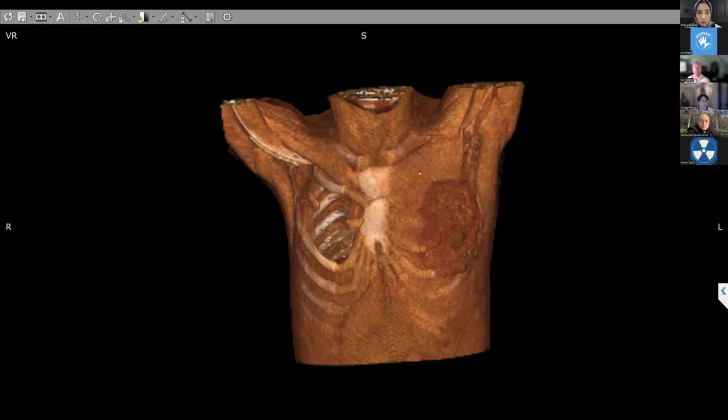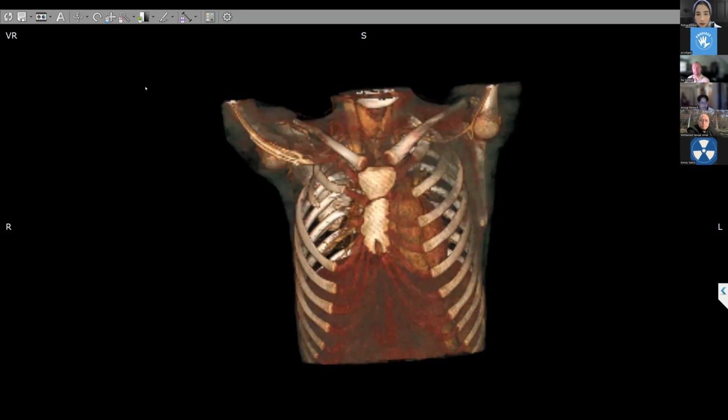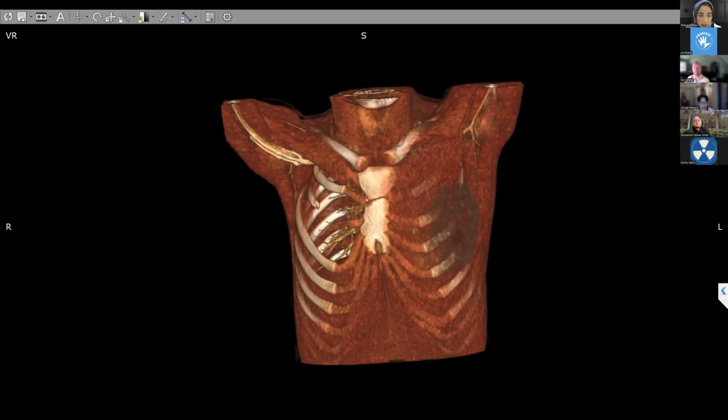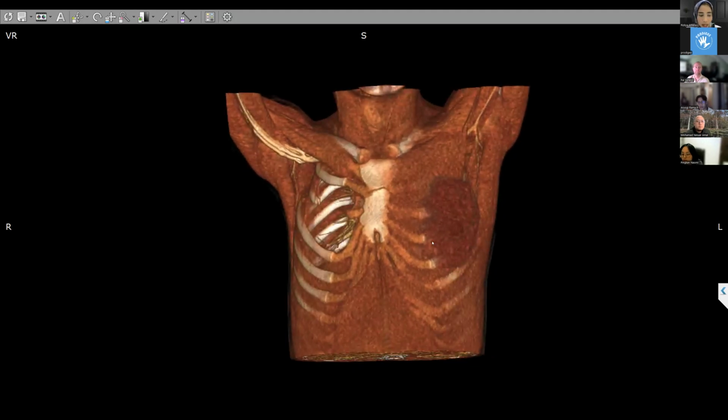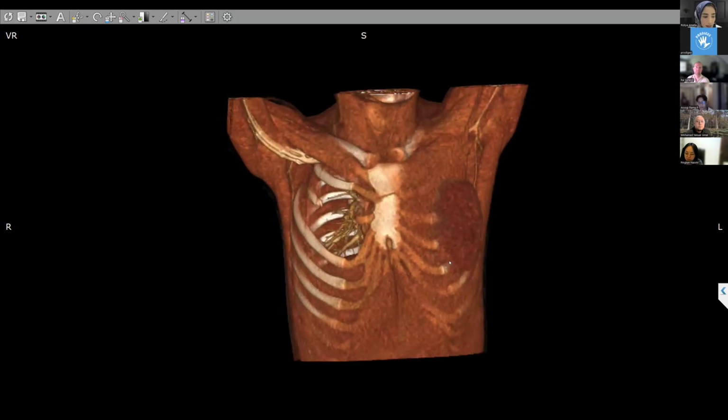What we need to know about Poland syndrome, for radiologists, we need to observe which muscles are involved, what is their extent, is it hypoplasia or aplasia, how far do they extend, is the breast developed, is there any bone dysplasia, because Poland syndrome may have a syndactyly, is there any vascular abnormality, such as arterial hypoplasia or agenesis, because some Poland syndrome patients have shown hypoplasia or absence of the subclavian artery, axillary artery, or brachial artery on the affected side. So it can reduce blood flow or cause anomalous blood flow to the chest wall and upper limb. So it must be observed from radiology.